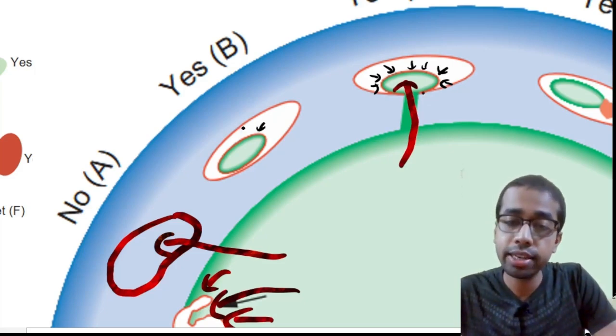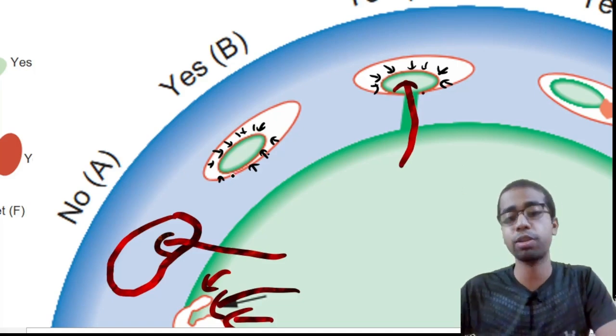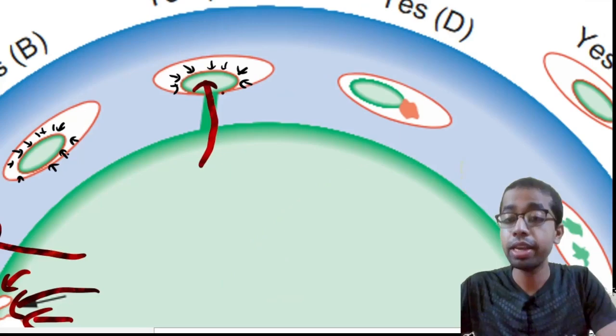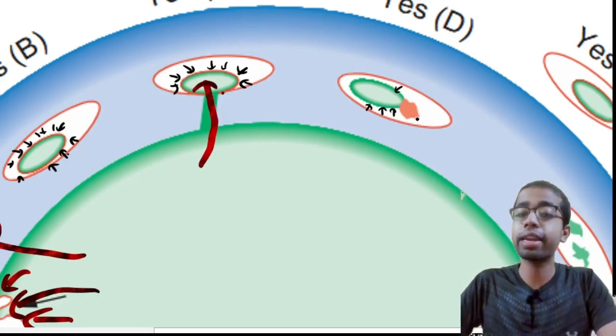Here also you can see, right? The follicles present inside the vessel are even surrounded by an endothelium. Not just the vessel, even the follicle part is also surrounded by endothelium. That again is suggestive of angio invasion. Now, if it is not surrounded by endothelium, see, there is no surrounding, there is no orangish hue.